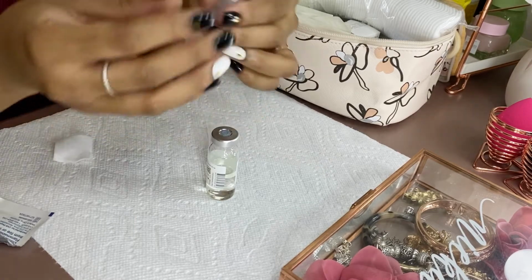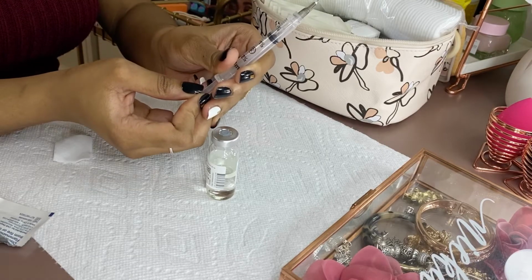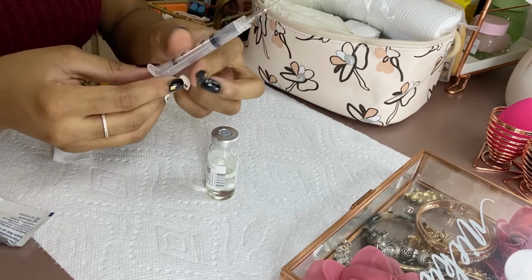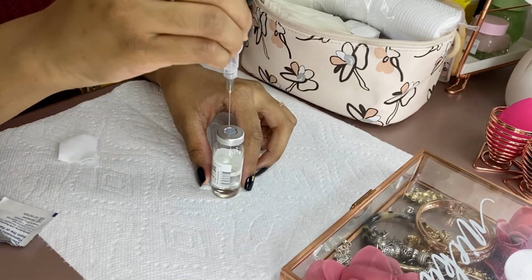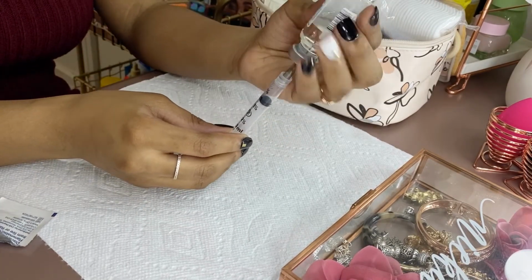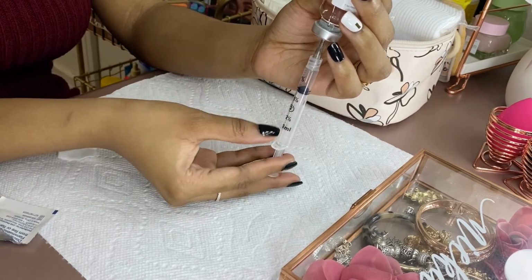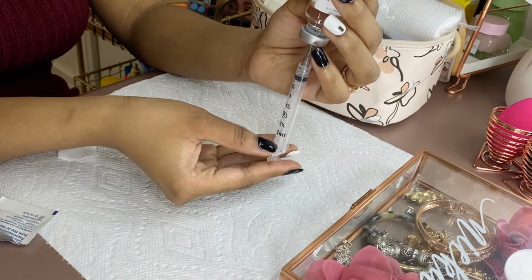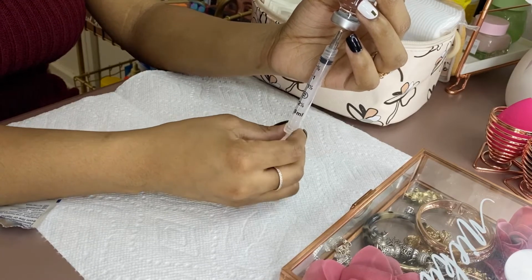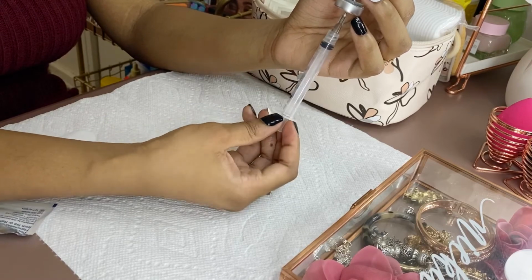I take off my needle. I have to take 1 milliliter, so I pull back the syringe to 1 milliliter to pull in the air. Then I flip my needle upside down and inject the air into the progesterone oil. I flip the progesterone oil upside down, at the section where I can actually see what's going on. I push the syringe back up to put pressure in the bottle, which helps the liquid flow, and then I draw it back.